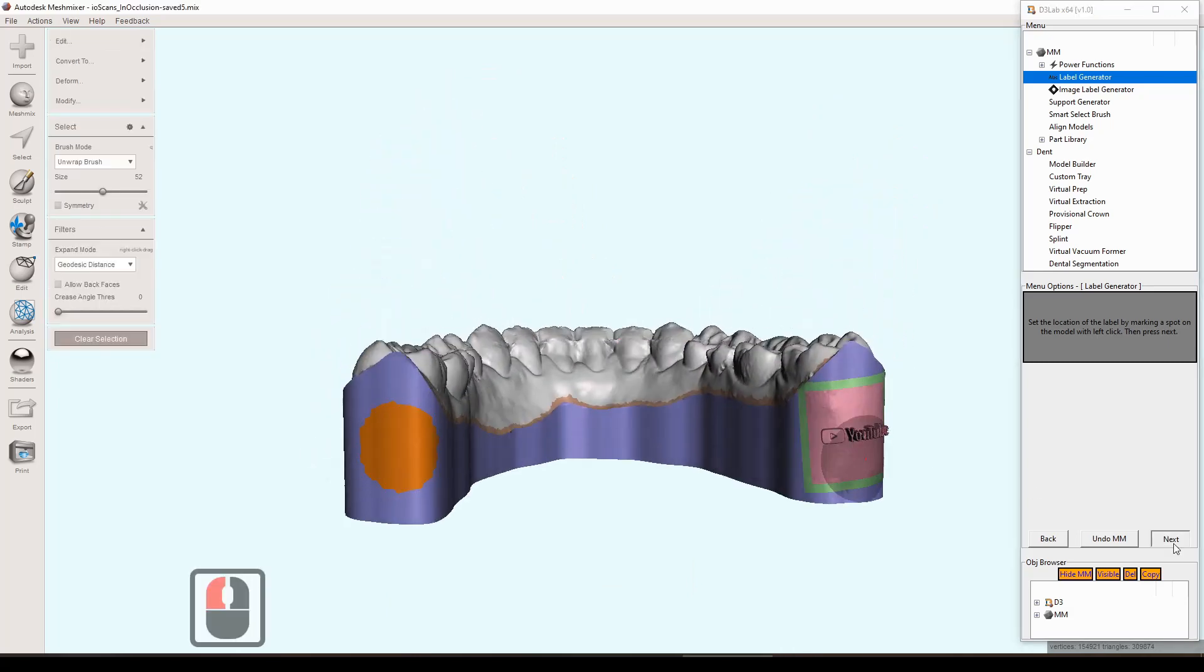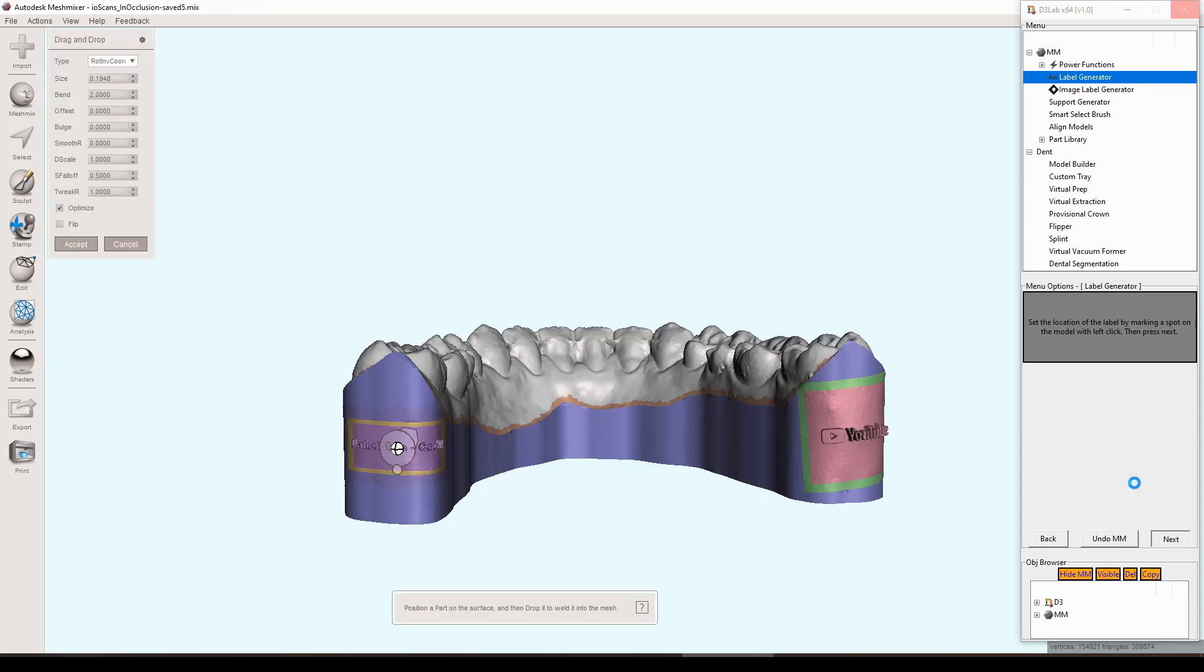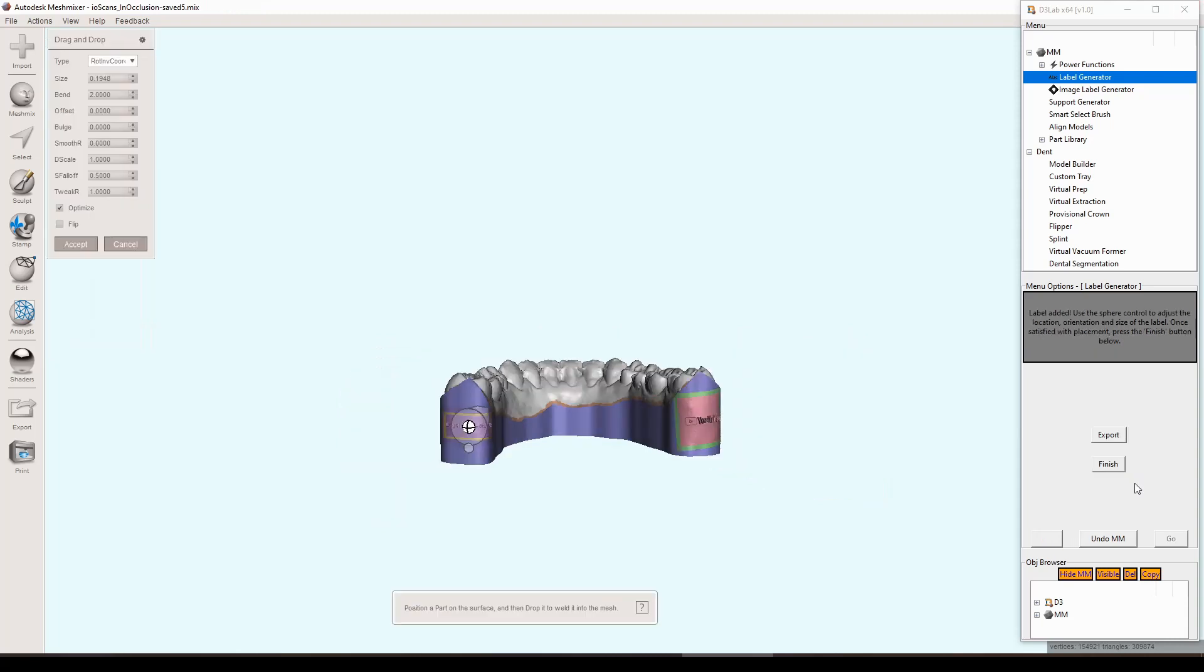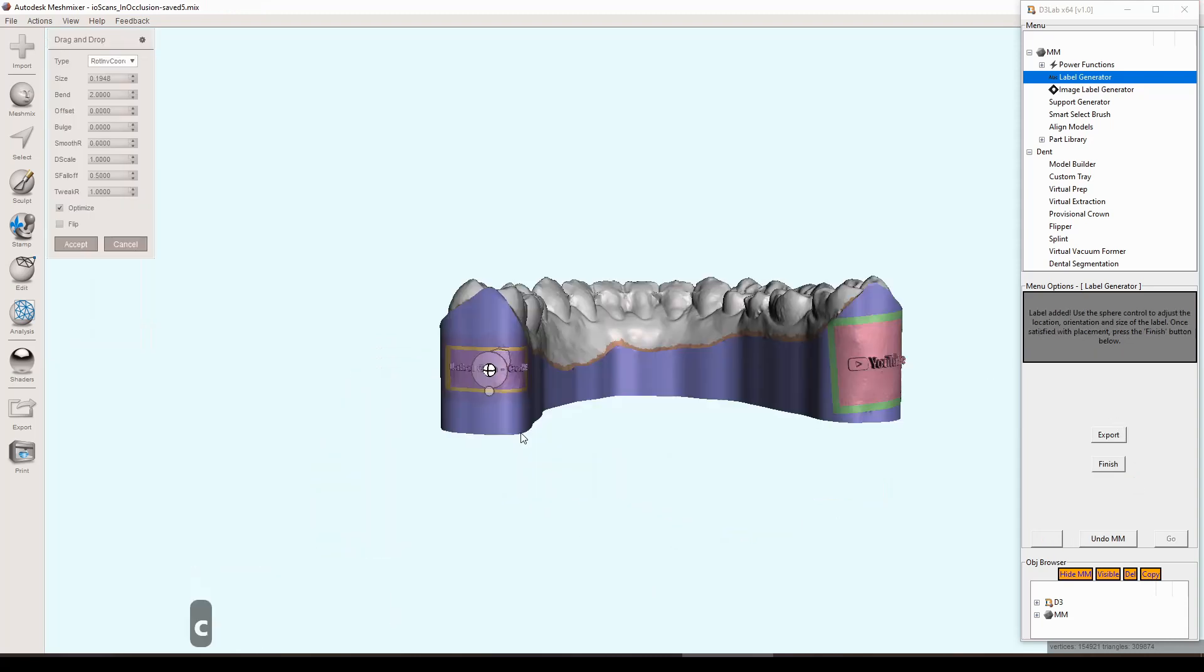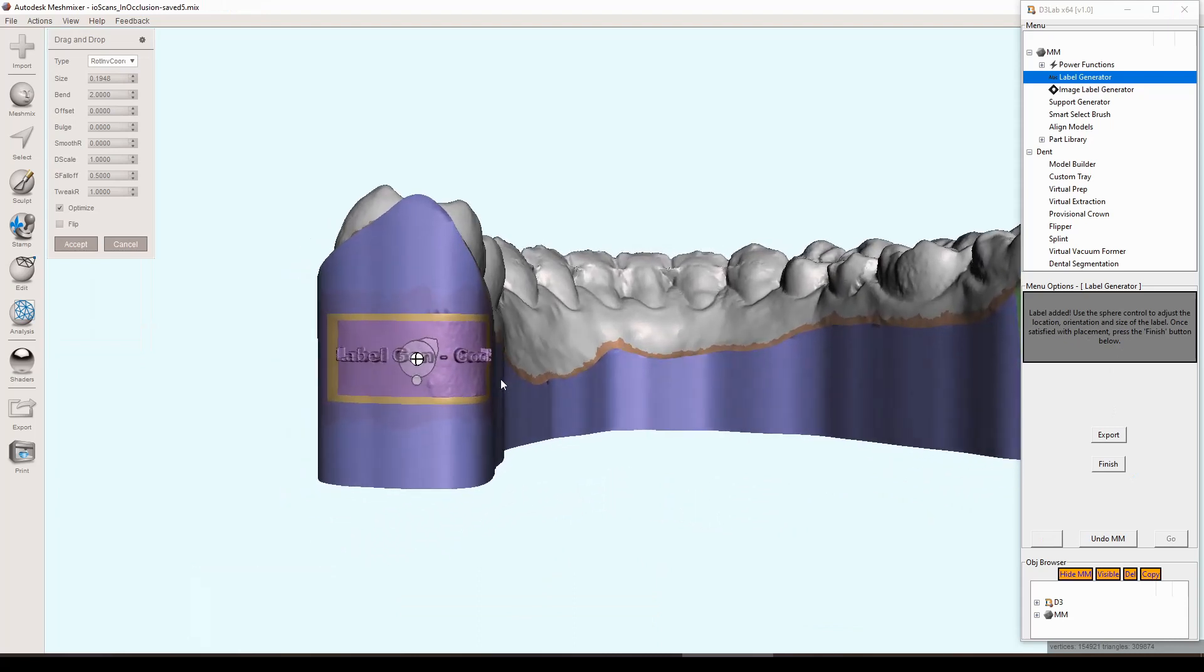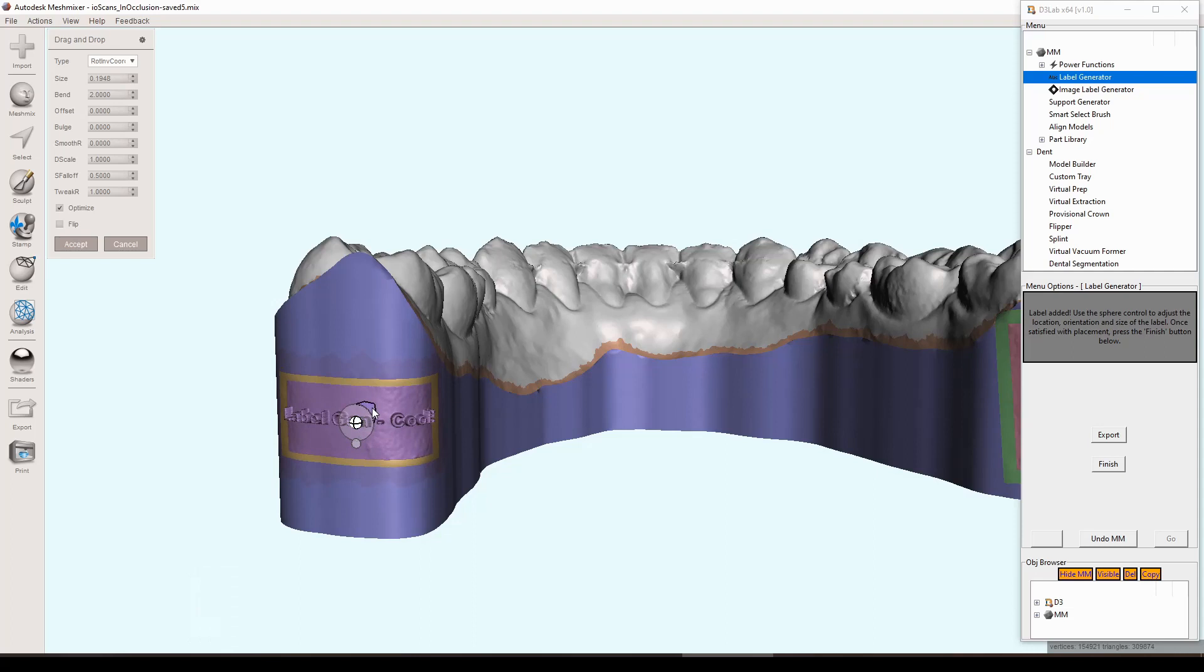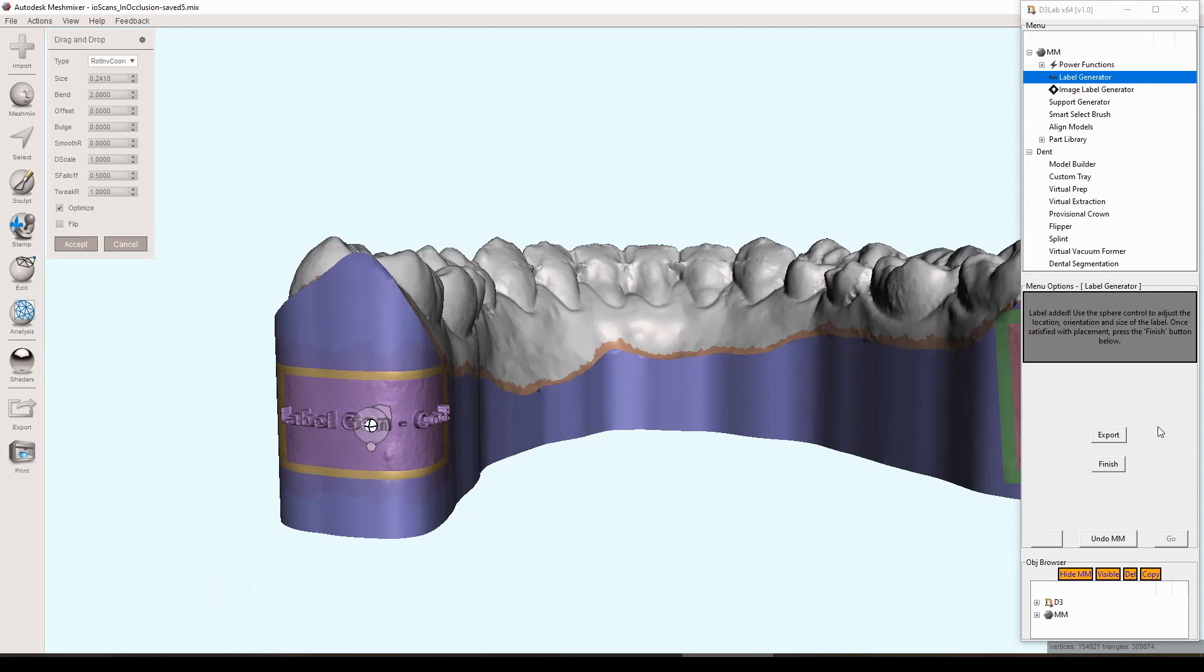We're doing the same thing we did with the image label generator. We're just selecting a spot on the model where we want this label to be. We'll put it on the other heel. This should be a little bit quicker than the image label generator because it's not as high of a resolution. Same thing applies here, we just need to orient it, size it, and once we are happy with the way that it looks we can use the finish button.